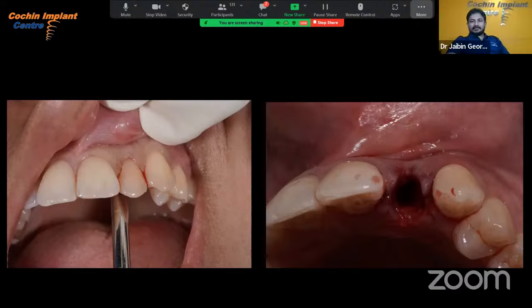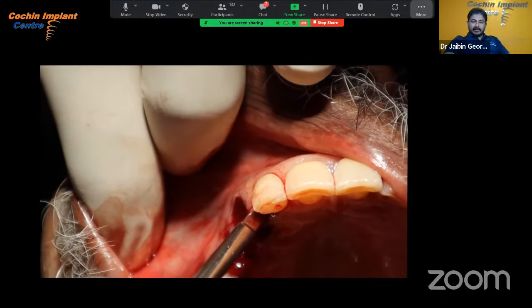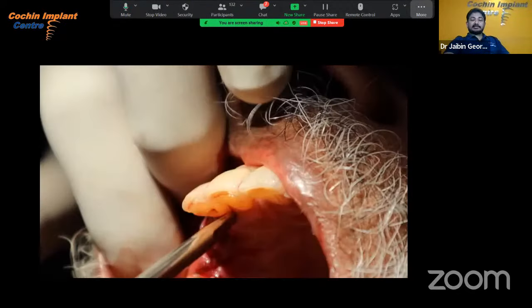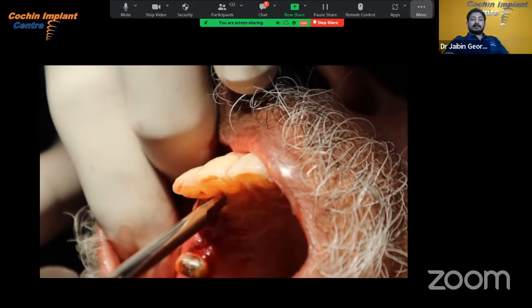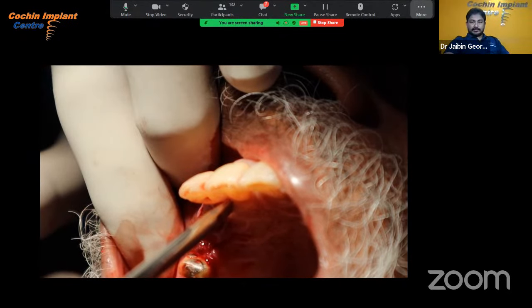We need to do a less traumatic extraction. In this case, I have used a magnetic mallet for the extraction. This is how we use a magnetic mallet. This is of a different case. We work on the mesiopalatal and distopalatal aspect of the tooth.